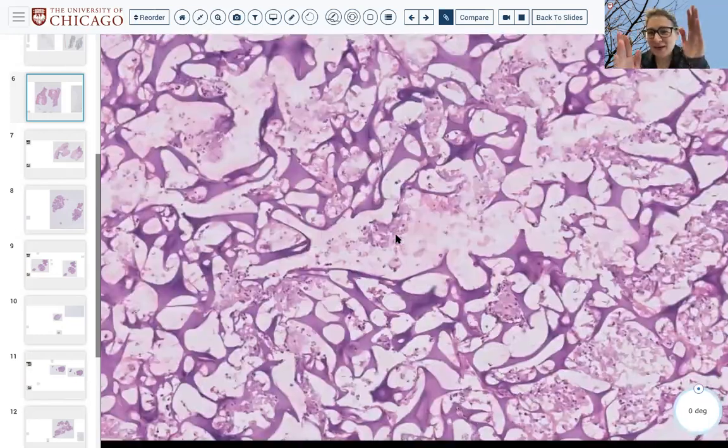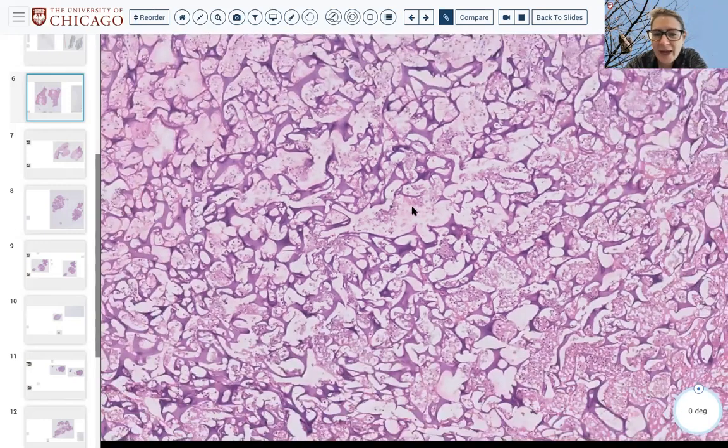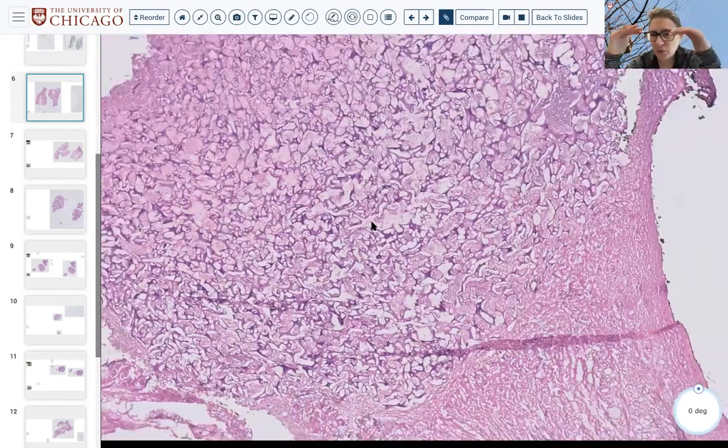So at least, so great. You recognized it as foreign material. I think that was step one, right? Whether it's embolic material: it's not really in a vessel, so probably not embolic material. Usually the embolic beads are kind of roundish. But yeah, this is packing. This is basically exactly packing gel foam for packing the wound for hemostasis.